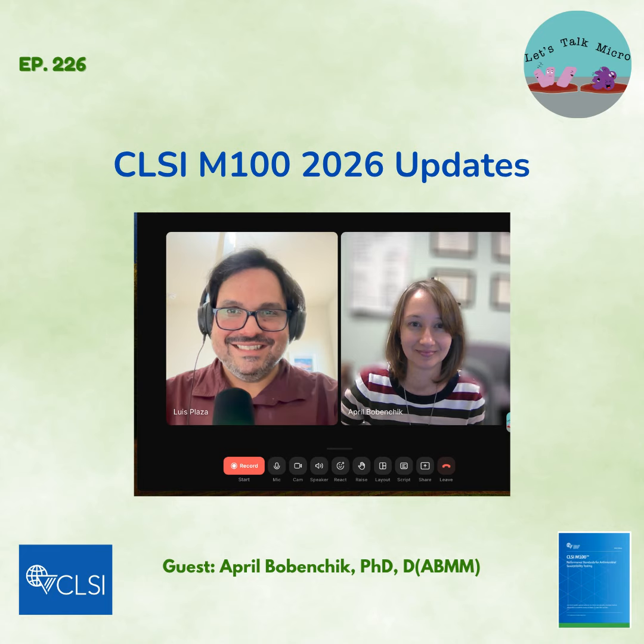And then there's some footnote updates that we made. When you go through the document, whether on Eclipse, M100 PDF, or even online, look for the overview changes. That way you can quickly review what's been changed in each section. We also bold every new edition revision in the document. So when we update some footnotes, you'll see the footnote will have just the updated, bolded language. So take a look at that.